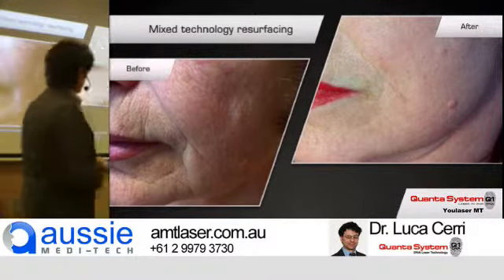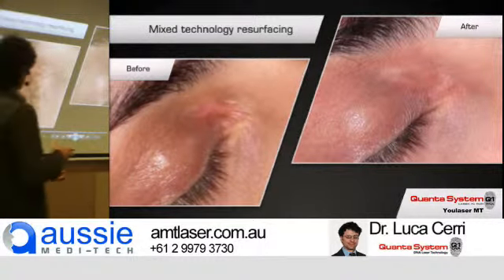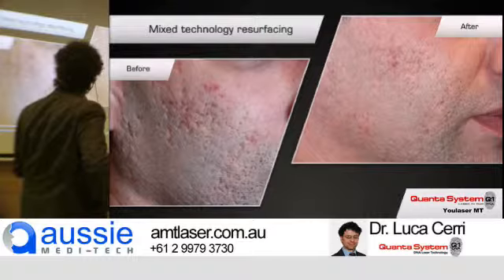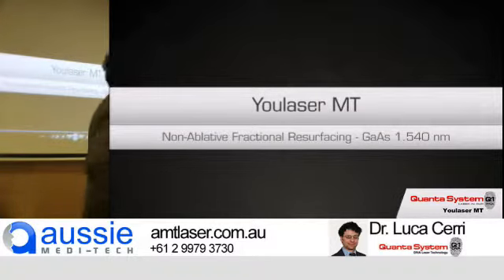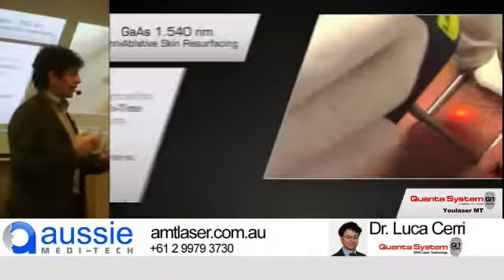In acne scarring it is the same. For acne scarring, for example, literature says that the 1540 is working well, and also the CO2 is working well. So why would we not combine these two effects that both work very well for acne scars? We will see the pictures better after. In this case, for example, is acne scarring after one session.